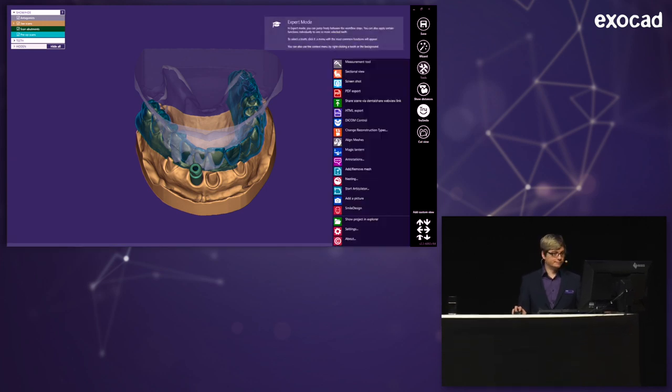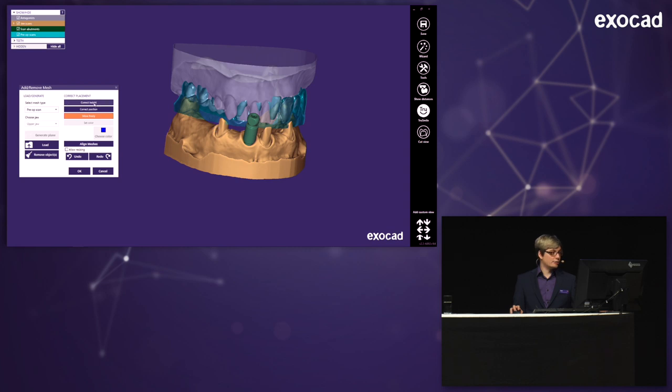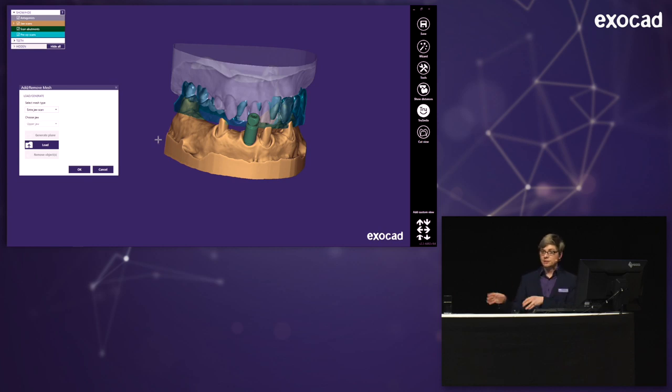And I can use here the add remove mesh function. And I'm actually adding the new scan now as an extra jaw scan. An extra jaw scan gives you the possibility to merge several jaws to one jaw, if you have different scans of the same jaw, and on one this part is good and on one this. You may want to do this.